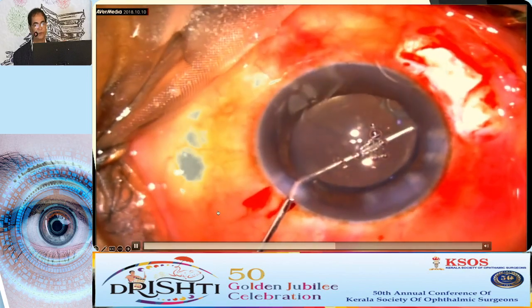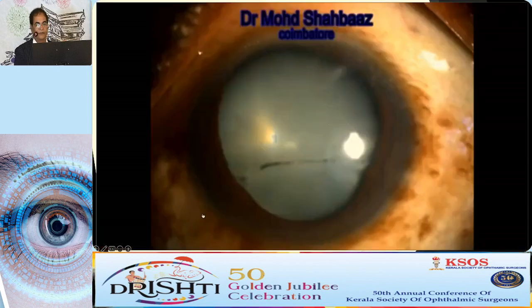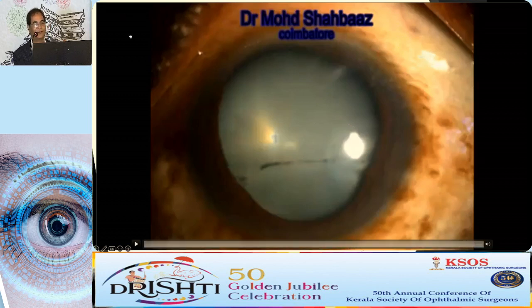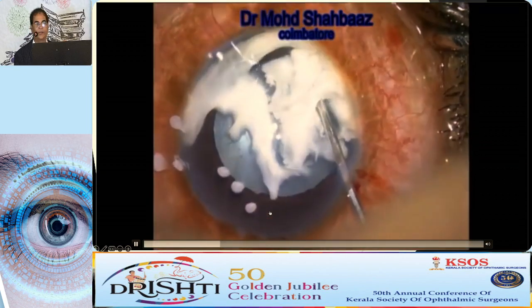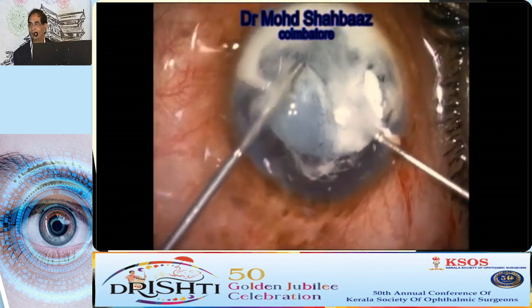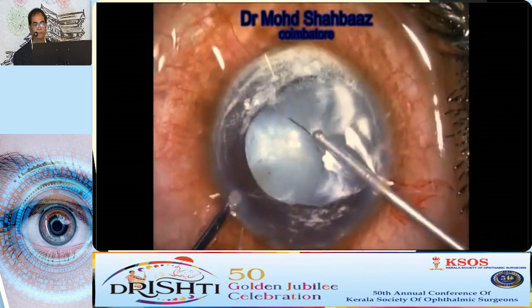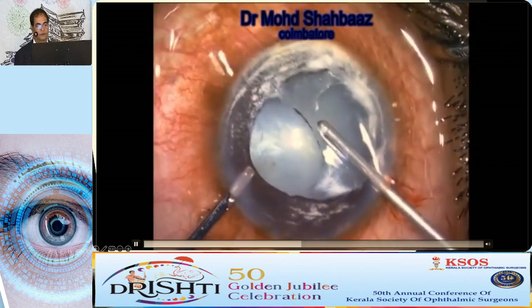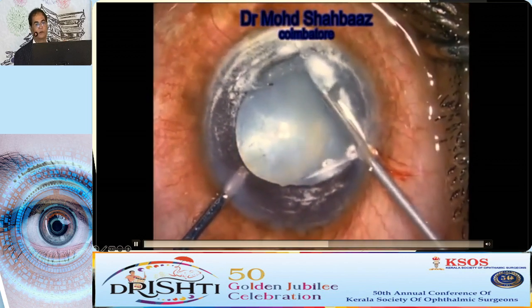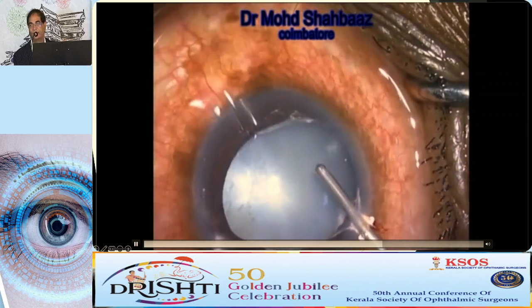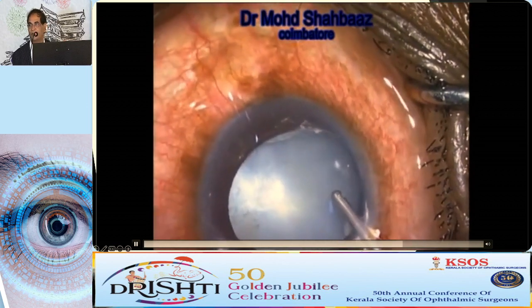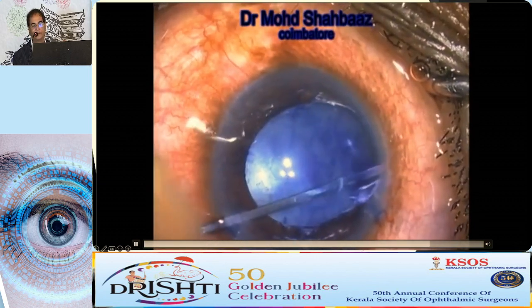Now you can go ahead and finish your cataract surgery. In this subluxated cataract case it is difficult to recognise which side has vitreous — anyone can get confused. The larger side is where the vitreous is, because the zonular dialysis is on that side. I used triamcinolone first because that demarcation line was confusing. After vitrectomy, you will find some vitreous incarcerated in your side ports — use a spatula to bring it into the centre and do additional vitrectomy.